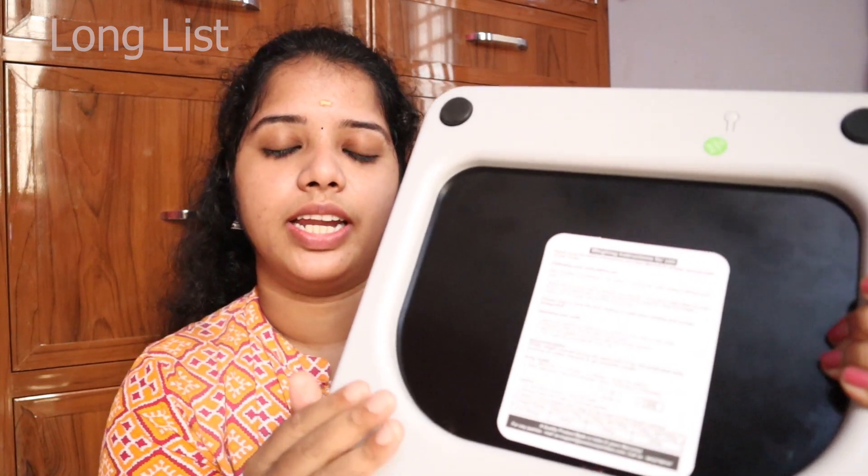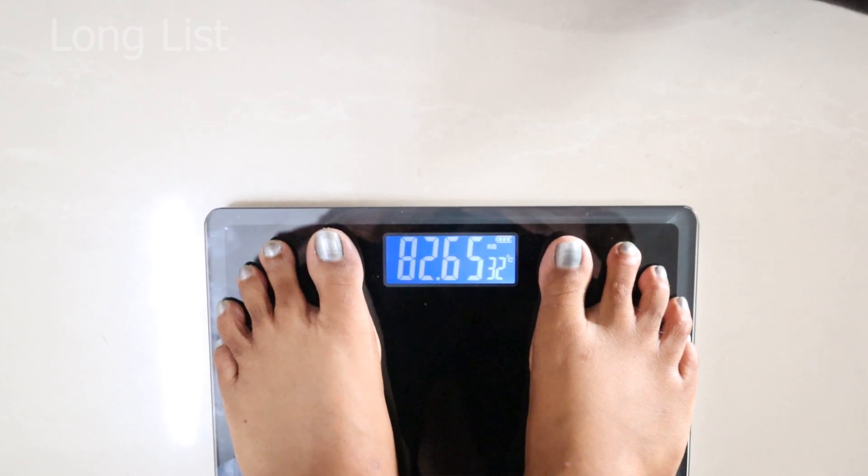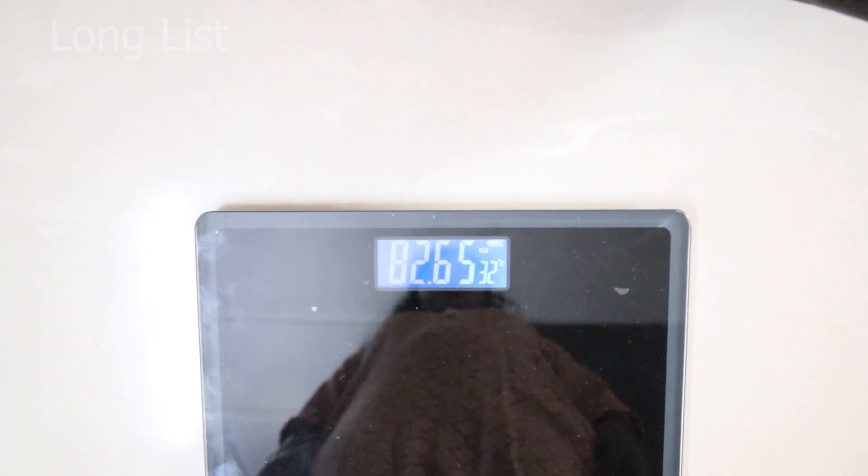You can change the battery on the back side. It uses 2 AAA batteries. Now the scale is ready. We have to check the weight. Round 1: 82.65 kg. You can press the button to reset to zero.